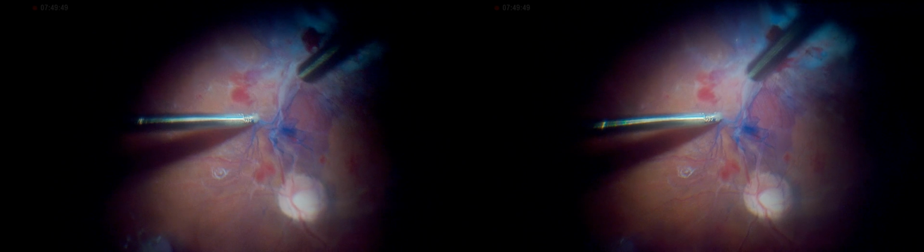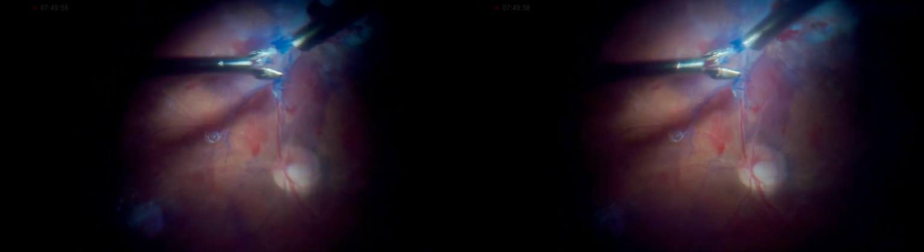A sclerosed vessel can now be better visualized due to the contrast created between the membrane and the nude area. Other areas are reached around the optic nerve and elsewhere, aiming at relieving as much ILM as possible. Finally, macular ILM peeling is completed as it looks pretty free now. Backflush cannula is used to remove remaining preretinal blood spots around.